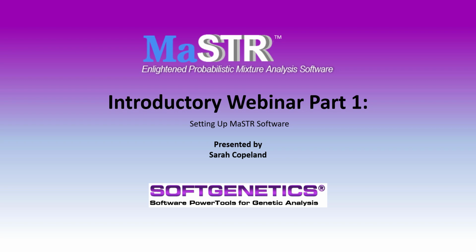My name is Sarah Copeland, and today I will be walking you through the steps of preparing MaSTR to analyze your mixture samples.